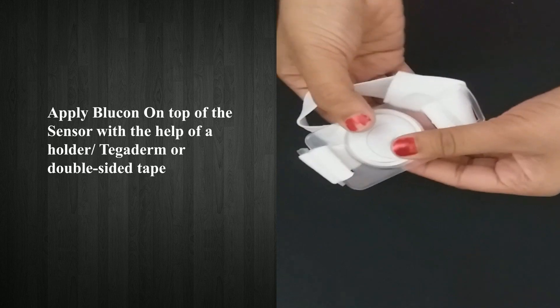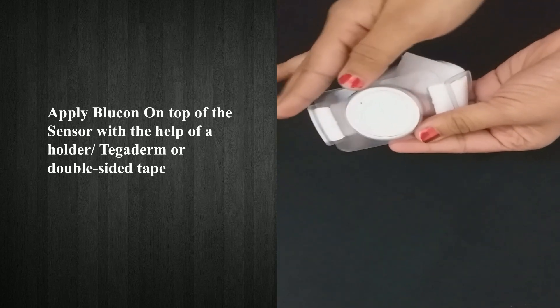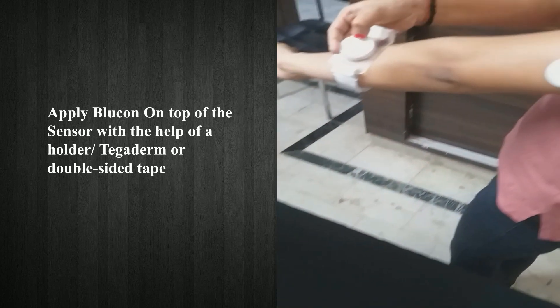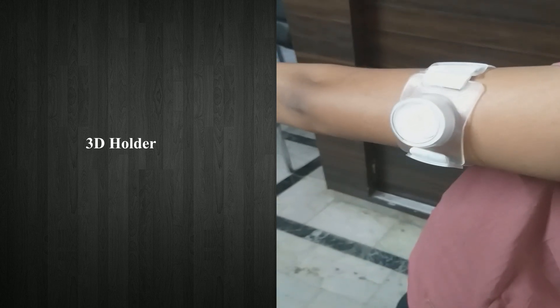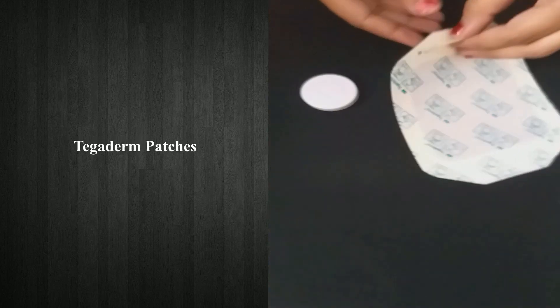Apply Blucon on top of the sensor with the help of a 3D holder, Tegaderm, or double-sided tape. Here are the 3D holder and Tegaderm patches shown.